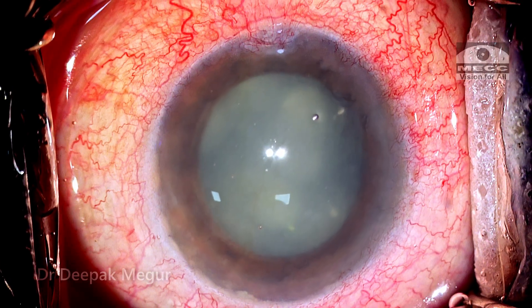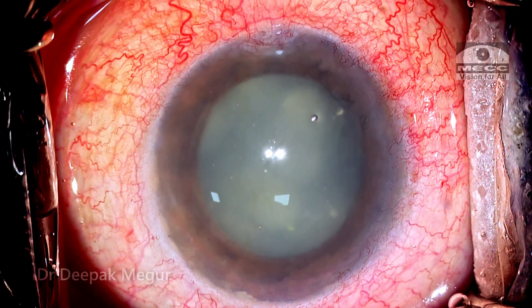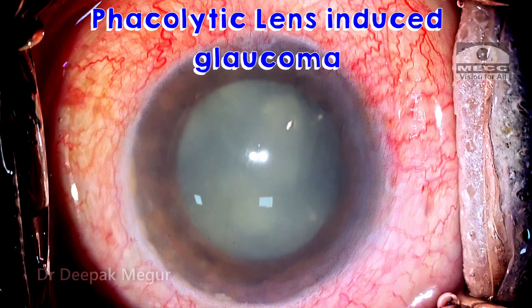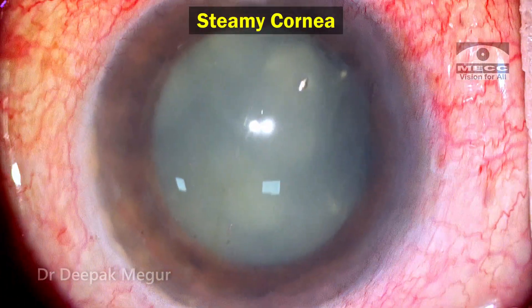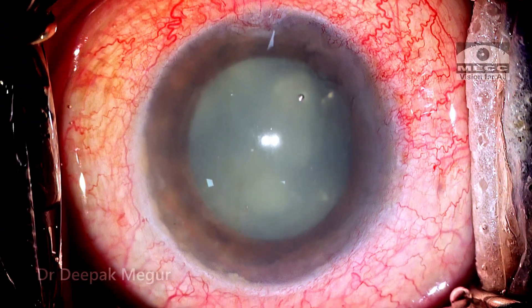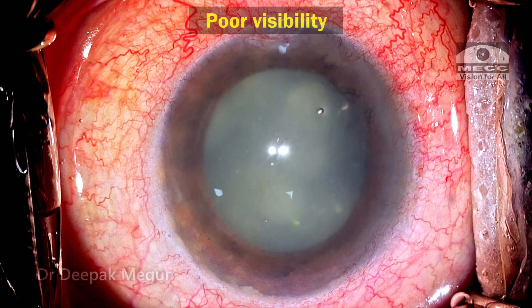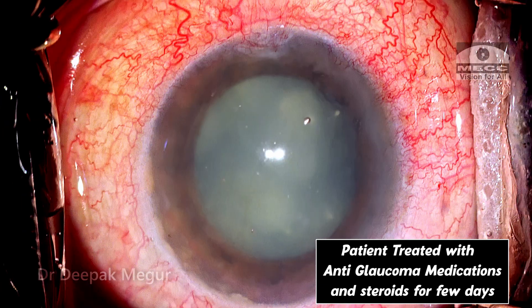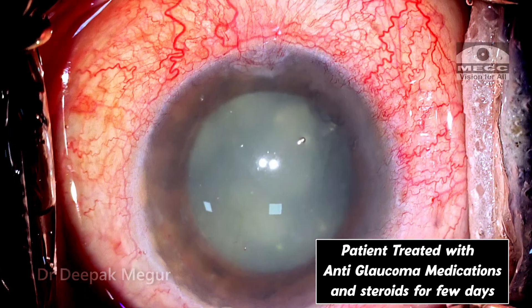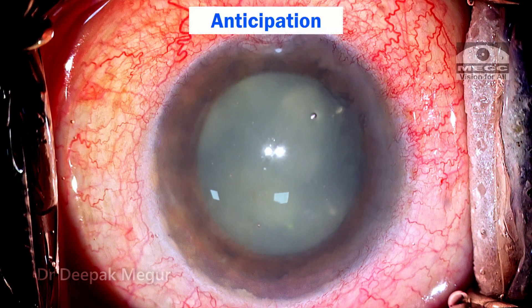She is a middle-aged lady who presented with severe pain, redness, and vomiting for the last 8 days. She had lens-induced glaucoma of the phacolytic variant. The pressures were extremely high, the cornea was very steamy, the cataract was not visible at all, and the anterior chamber was already filled with lens particles. After a couple of days of steroids and anti-glaucoma medications, she was posted for surgery. This is how the eye looks after intravenous mannitol on the table — I'm anticipating a difficult surgery.